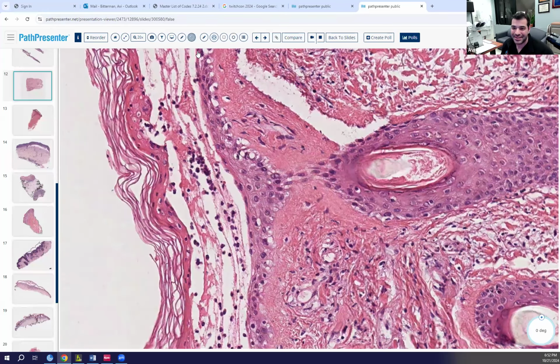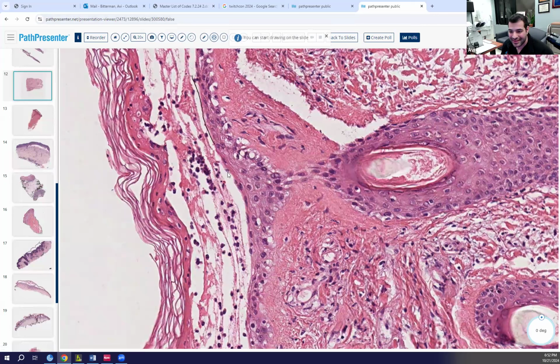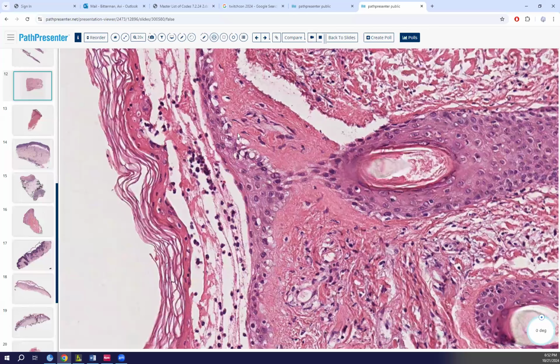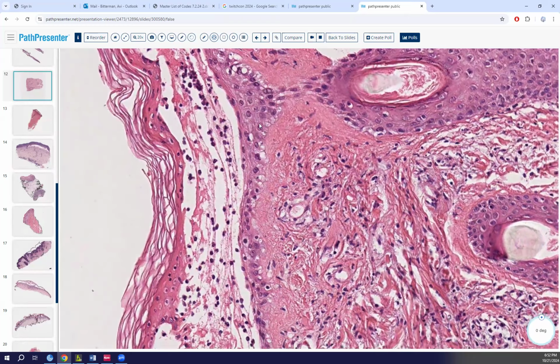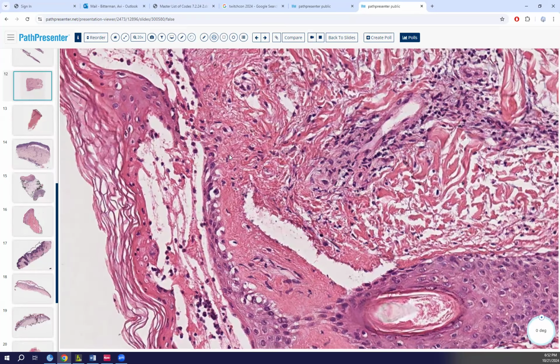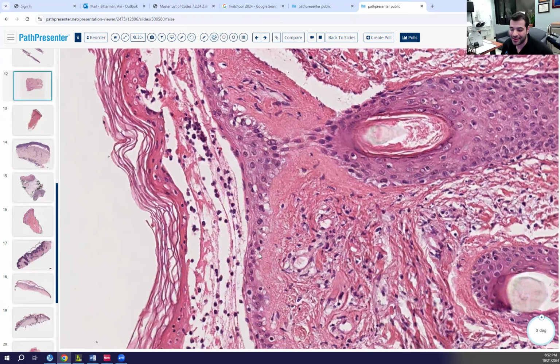You can see it like this. You see how this is more eosinophilic up top here? Even the basal layer is not going to look as cuboidal as the basal cells of a typical epidermis. So they all look more squamatized. Oh, even the basal layer. Okay, that's helpful.